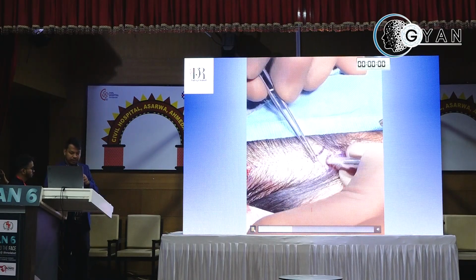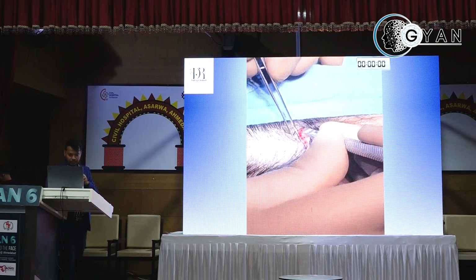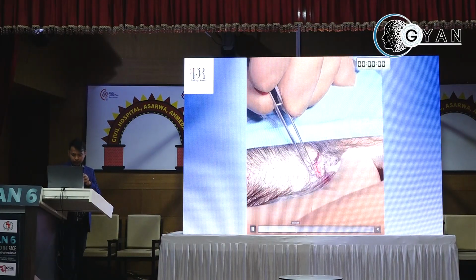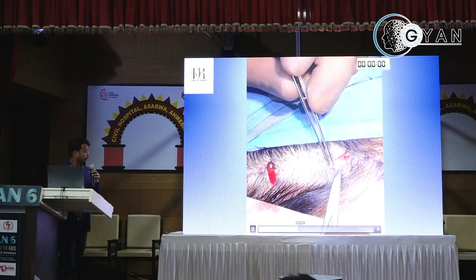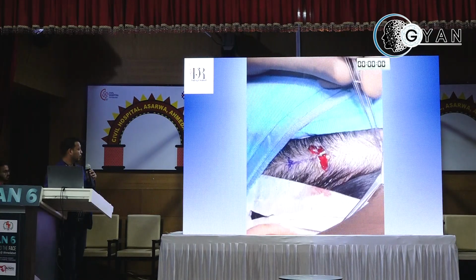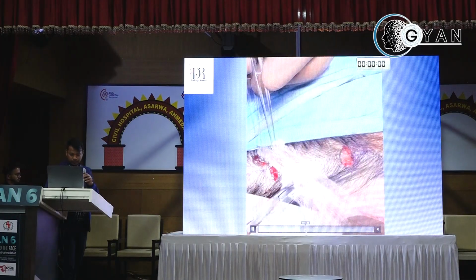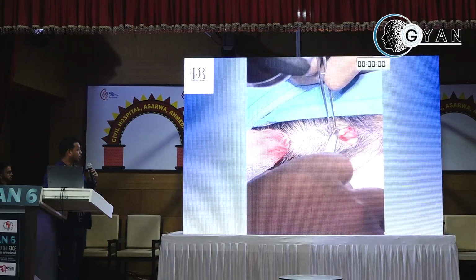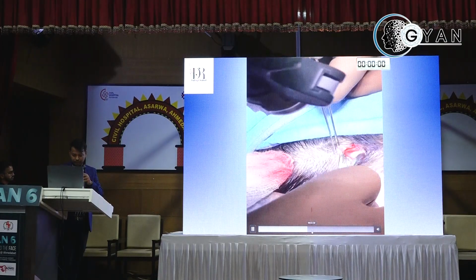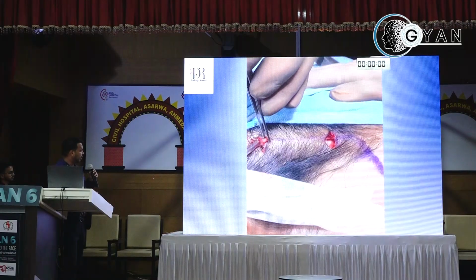Again the same 2 incisions. Medially, again, the same plane. We give a bevel incision so that our hair follicles will be preserved. Once we go in, with blunt dissection we reach the deep fascia. So now the deep fascia is exposed. Once we expose both sides, in a fanning motion we run the periosteal elevator to release the required fascia.